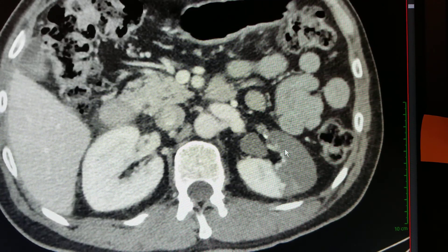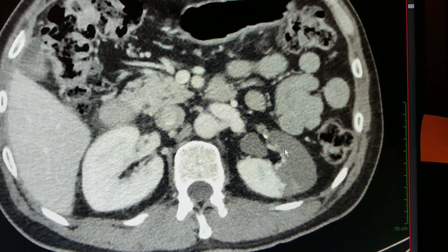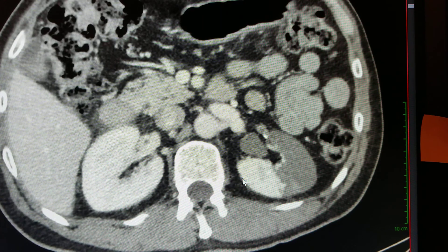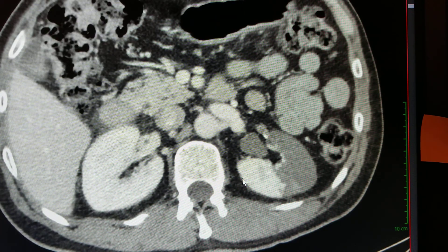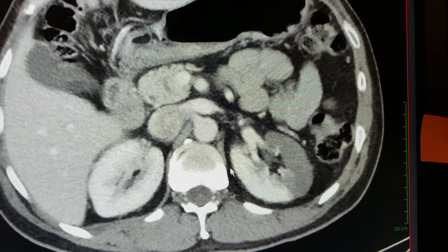This is a case of renal infarction, probably caused by a thromboembolism, because there's no aortic dissection. Embolism can usually be from a heart valve, it could be from atrial fibrillation, or it can come off the aorta. Not sure of the specific cause in this case.